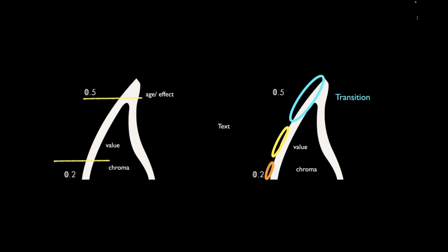If I want to make the middle third a little brighter, I'm going to use something more value-based, something whiter like EE1 or Pearl or whatever kit you're using, TI2, right? Something that's much more of a whiter reflective material. And then as I get towards the incisal edge, I might use a mix of several materials. Why? Because I might want some light to pass through, but not all of it. I might want to show the mamelons or not show the mamelons.